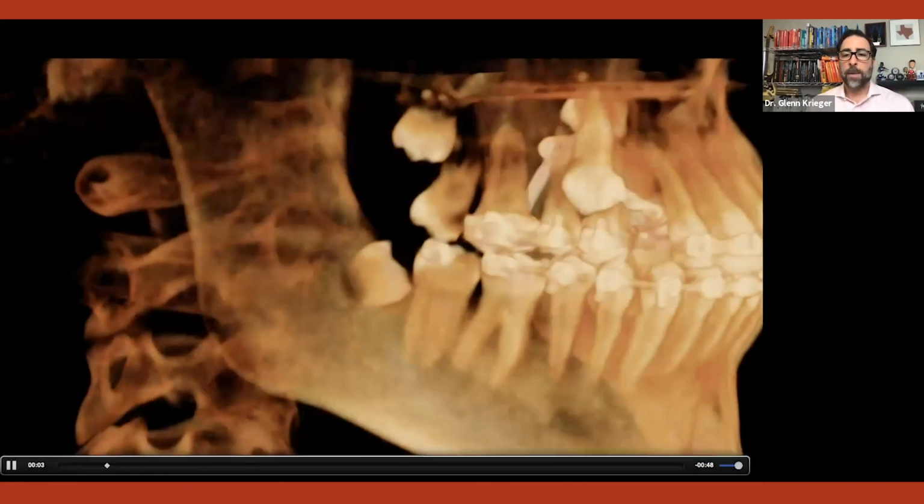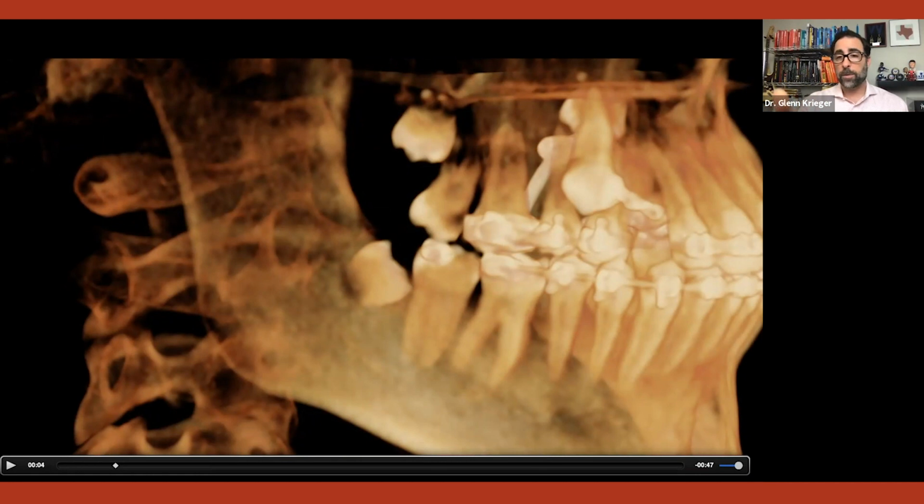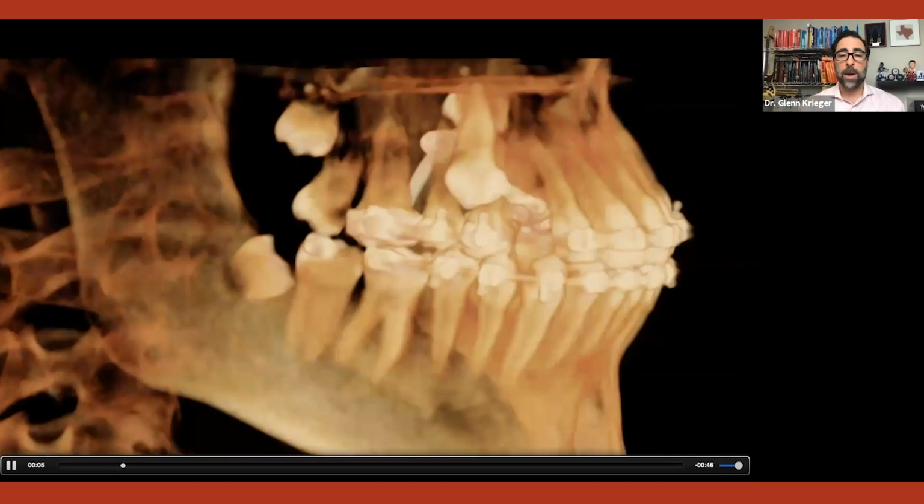Now, again, I can stop at any point along the way when I take a CBCT and really evaluate not only the position of the tooth, but more importantly, what's going to broadly occur to most of my repositions for my normal, not abnormal patients, in terms of root position. I'm going to really be able to see in 3 dimensions where my roots are, so that I can get a better idea of root position and reposition than I would if I was just taking a panoramic x-ray.